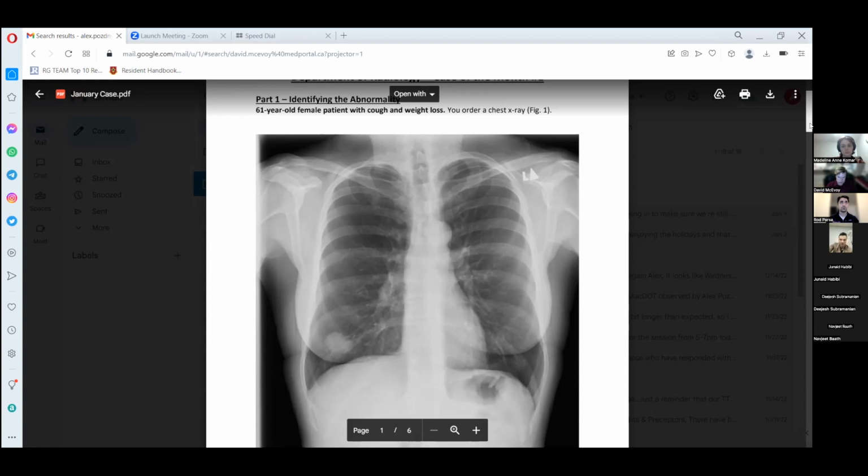So maybe in order to make it interactive, we can always get someone to answer. I'll just ask some open questions, and anyone can feel free to answer. When we're thinking about a radiograph, and we're seeing the brightest parts, the whitest parts, are those the ones that have the highest density or the lowest density? Those would have a higher density? Yes, exactly. Very good. So respectively, the darker parts would have the lower density.